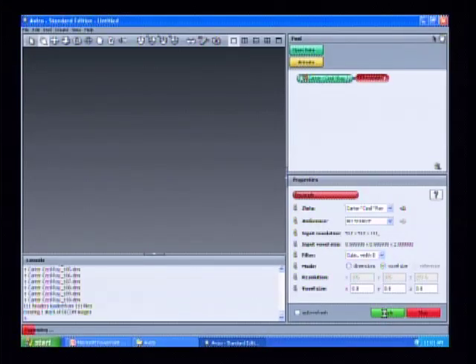This is mostly important because we've used live patients. When we work with the Anthropology department and we just send the bones through, we obviously scan those with as high resolution as possible, and then we have these bone models that are highly accurate, and we can't do that with the live patient, so we have to do some image processing to try to fix that. Exactly. So you just want to hit apply.